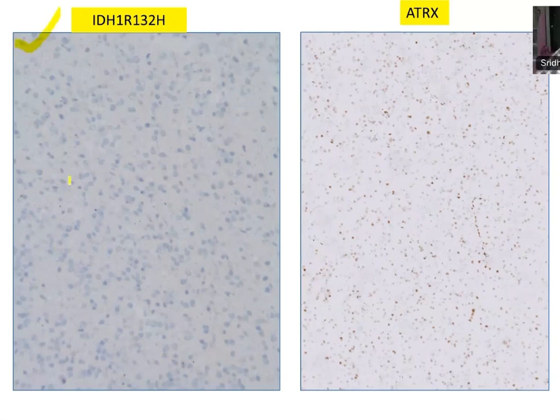Is it showing any other cells which are positive? Here, I'm not able to make out in this field, sir. So are you expected to see any positive cells in IDH1 R132H? No, sir. So then it is negative. This is an abnormal protein. There is no internal control for IDH1 R132H. You should always use the external control. When there is no stain, you have to interpret it as negative.